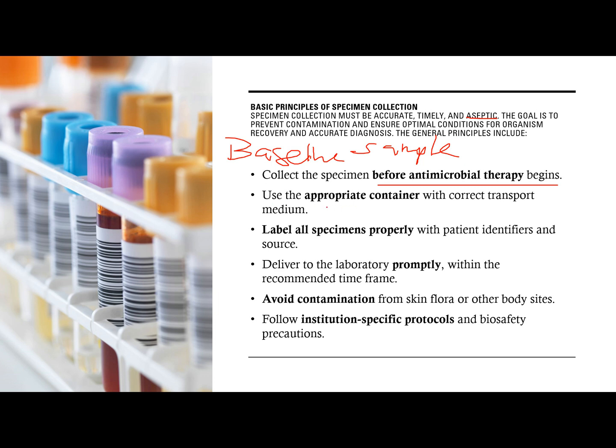Then use the appropriate container with correct transport medium. So imagine if you're gonna be collecting a urine sample, class, for urine CS, ang binigay sa'yo ng patient is in a glass jar container. So you have to reject that, class, kasi it could contaminate the sample.